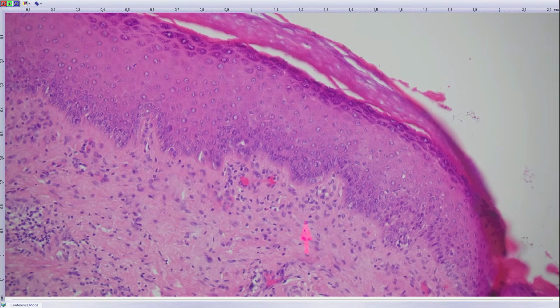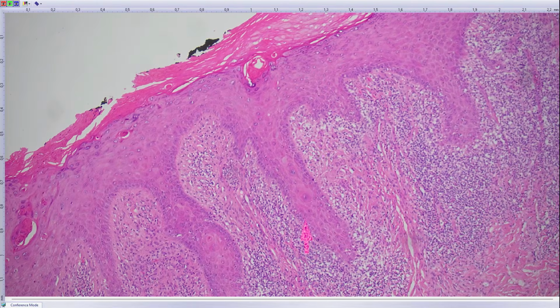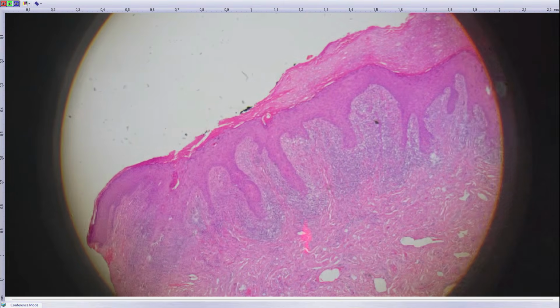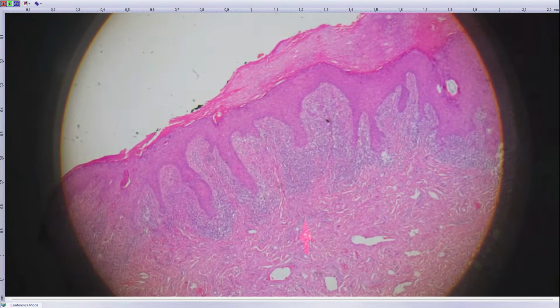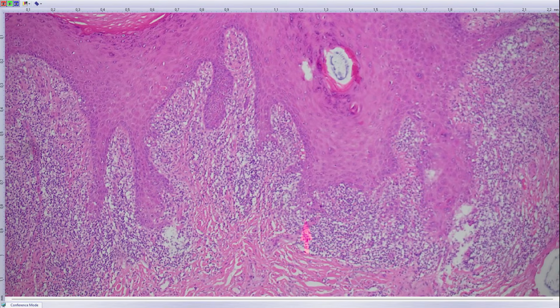Yeah, this is a differentiated type of dysplasia, and I think that what is seen in the patient, typically, prolonged rete ridges, and at the tips of the rete ridges there is absent basal membrane, and they invade in thin staghorns into the dermis.